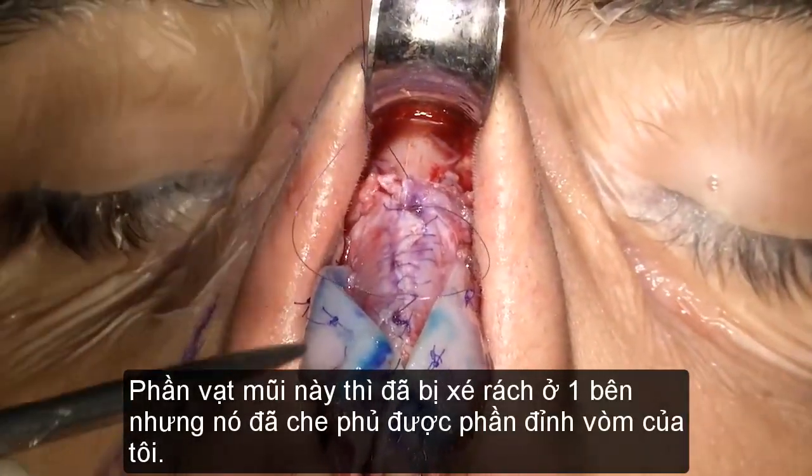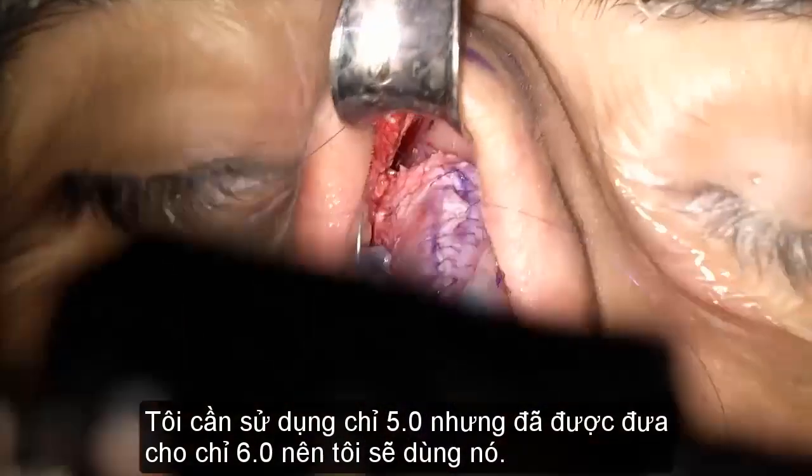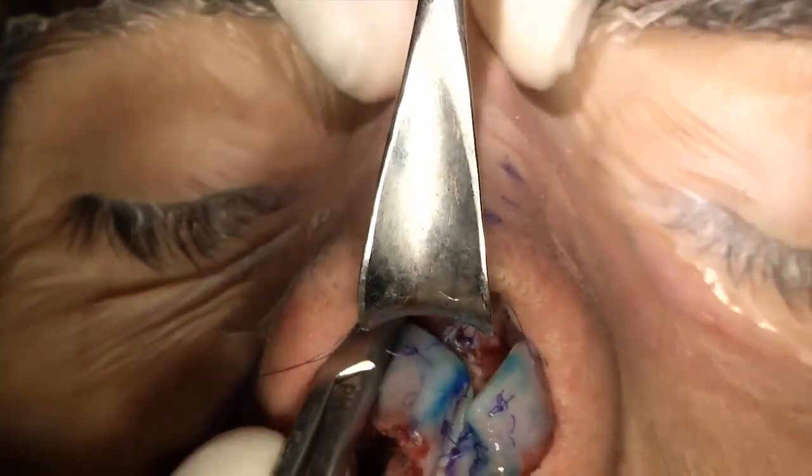So this flap is torn on one side, but it's just covered my keystone. I should have used a 5-0, but I was given a 6-0, so I will bring this somewhere.